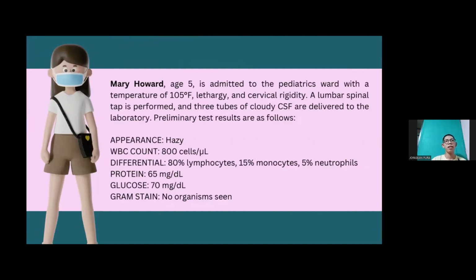Mary Howard, age 5, is admitted to the pediatrics ward with a temperature of 105 degrees Fahrenheit, lethargy, and cervical rigidity. A lumbar spinal tap is performed, and 3 tubes of cloudy CSF are delivered to the laboratory.